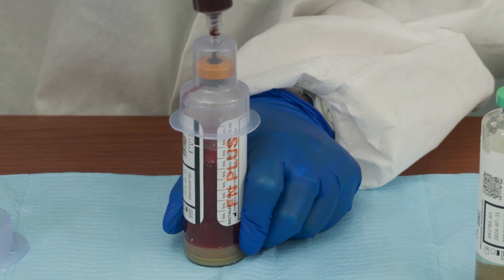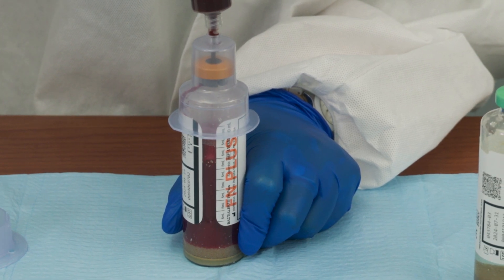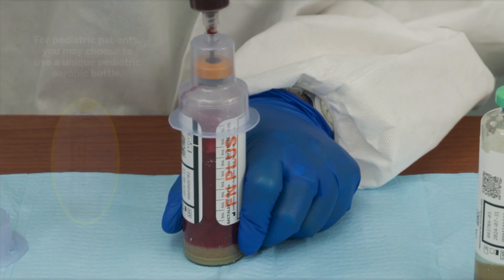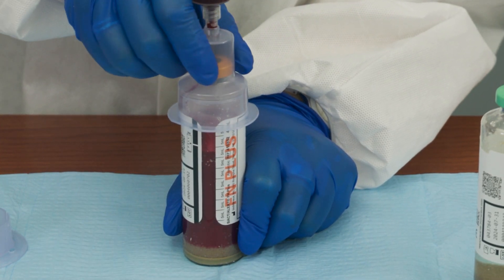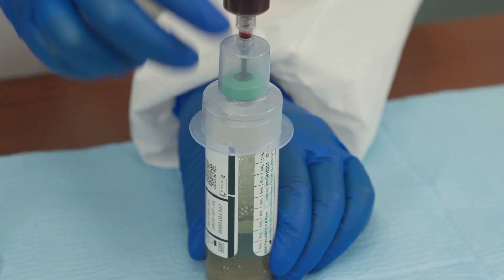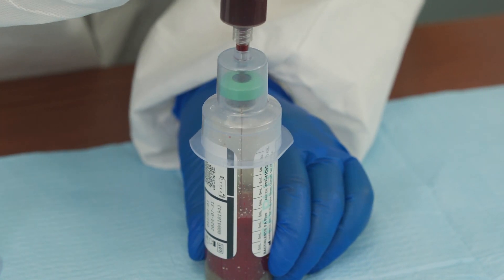Use the fill tube mark to accurately gauge the sample volume — 10 milliliters per adult bottle. For pediatric patients, you may choose to use a unique pediatric aerobic bottle. Once the anaerobic bottle has been inoculated, lift the syringe and transfer device off the anaerobic bottle and repeat the procedure for the aerobic bottle.